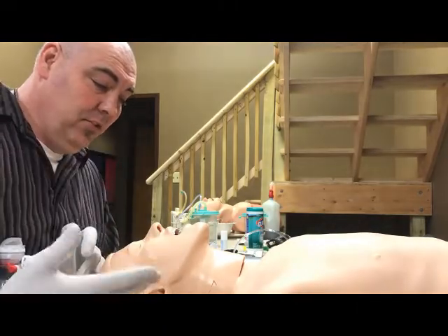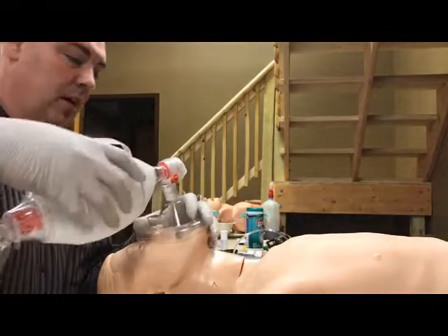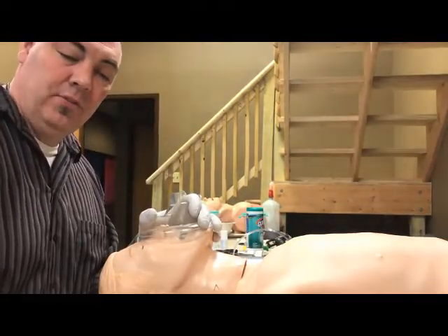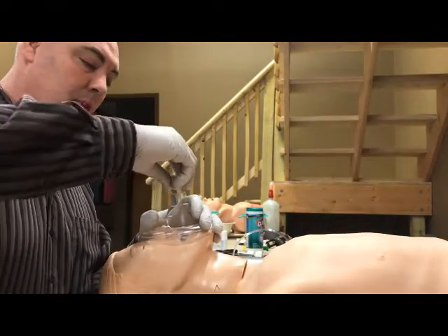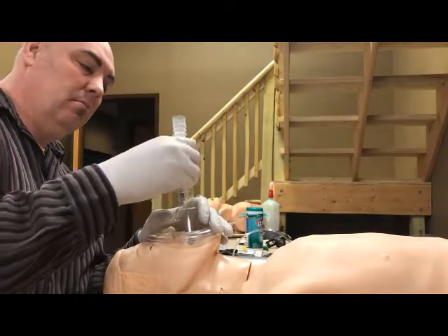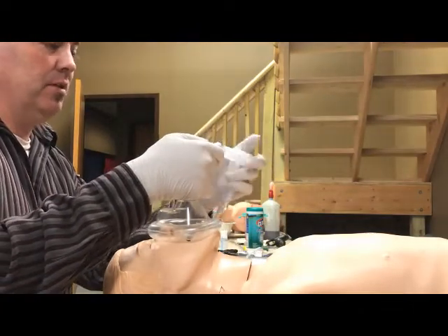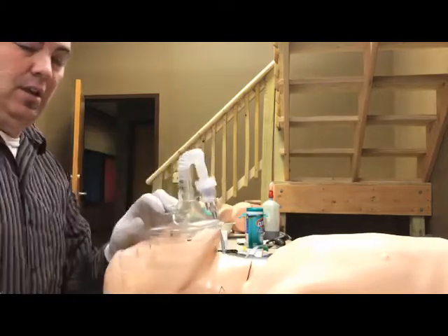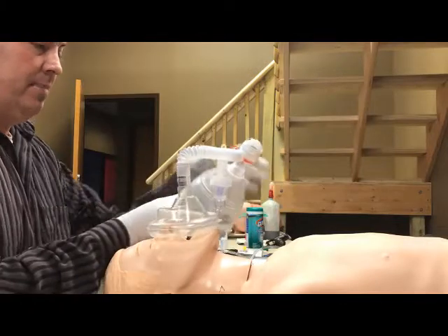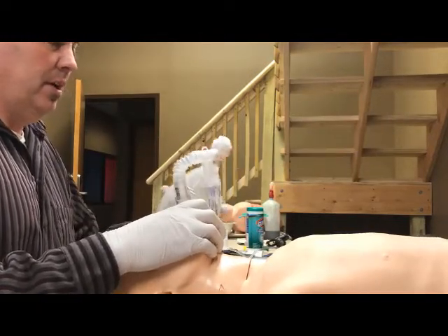If you have not yet intubated the patient and are still using BLS airway, the process is the same. With the BVM assisting the patient's respirations, it's the same setup except there's no ET tube in the way. The adapter goes into the mask, then we take the corrugated tubing and attach the nebulizer. The BVM attaches to the other side of the T-connector. We get our seal, open the airway, and assist ventilation that way.